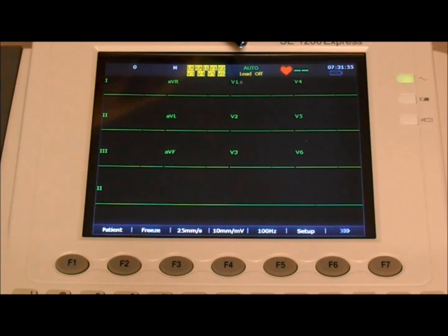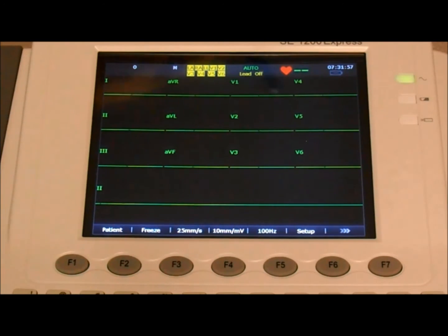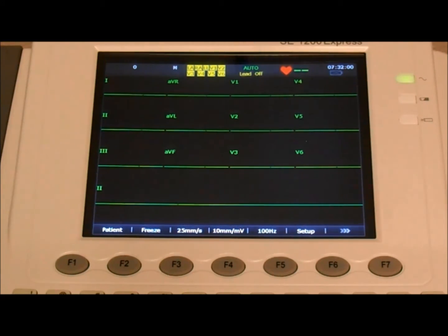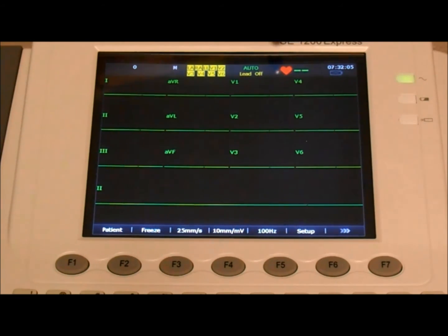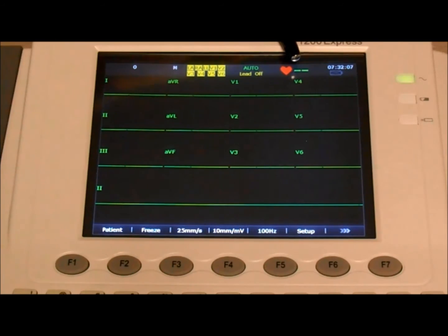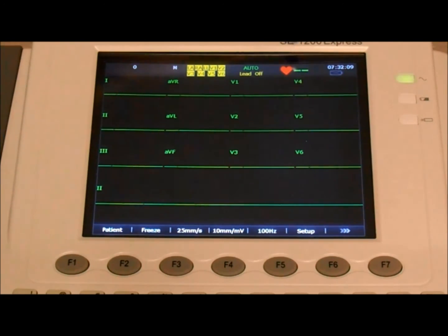Next, we have the work mode, which we always wanted as auto, because that's what's going to give us this 10-second sampling report. And finally, we have the heart rate. If we have an actual patient connected, the heart rate would be reflected here.